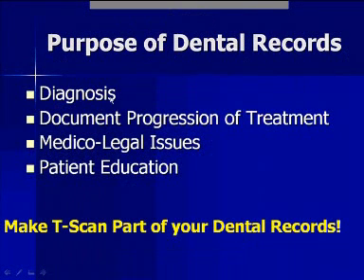We take dental records for many reasons. We take dental records so that a diagnosis can be made. We take records so we can document progression of treatment, obviously for medical legal reasons, and educating the patient is also another reason we take records. Today, in the day of paperless practices, using the TScan is becoming more and more user-friendly because you're also computer literate.